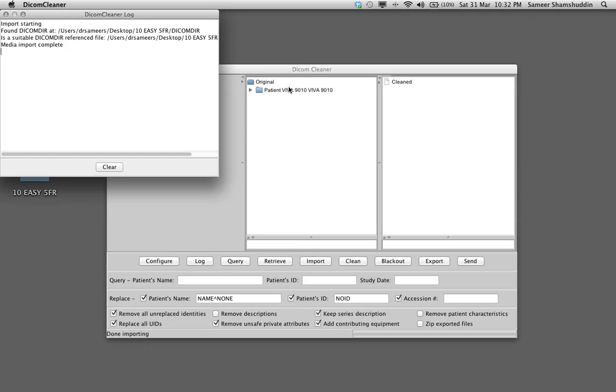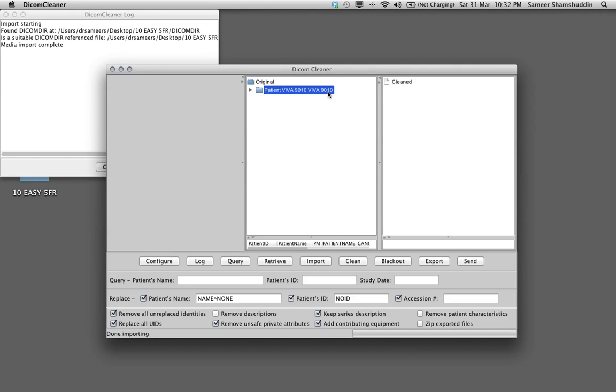This case will get imported. You can see on the left hand side that there is patient Y19010Y19010. This is the case that I need to rename.